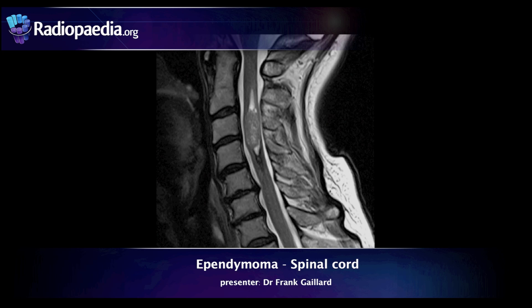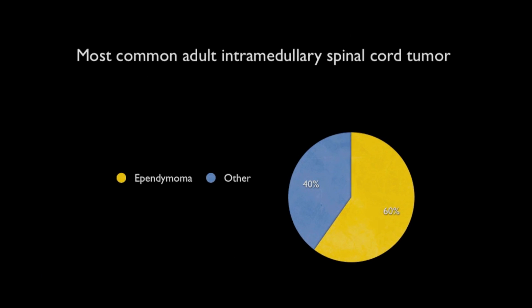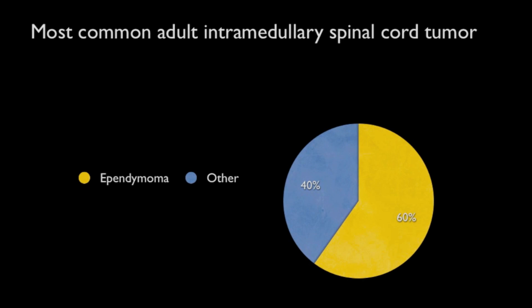This is Frank Gaylord from Radiopaedia.org and today we're going to look at spinal cord ependymomas. Ependymomas are the most common intramedullary tumour in adults, representing approximately 60% of all such tumours.